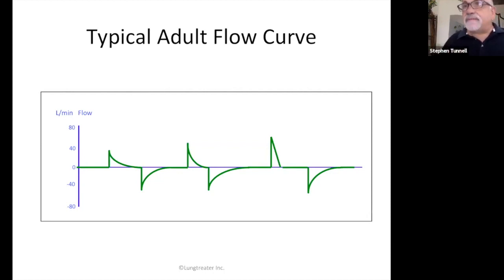We do the same thing, but we don't have a faucet. We have these solenoid valves. As we increase that, with the valves opening, we see a higher rate of flow. As the lung gets filled up, the flow tends to stop. If you took your hose and pinched it off, the flow would stop. And that's the exhalation valve in some ways.